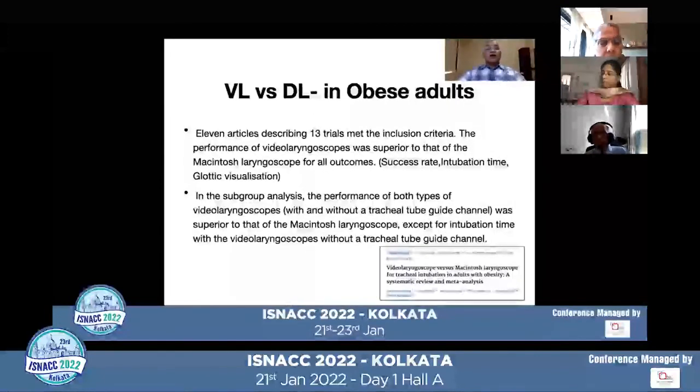Again, another meta-analysis in obese adults identified that the performance of both types of video laryngoscope, with or without a tracheal tube guide, was superior to that of the Macintosh laryngoscope, except for intubation time, where the channel video laryngoscope works better.